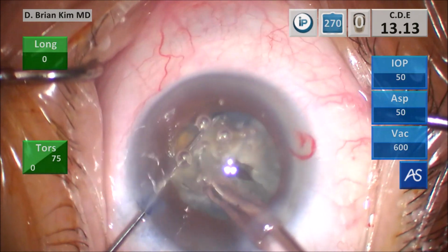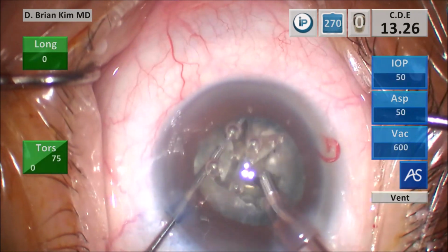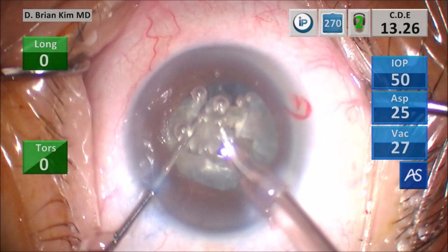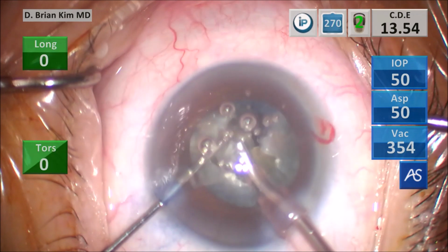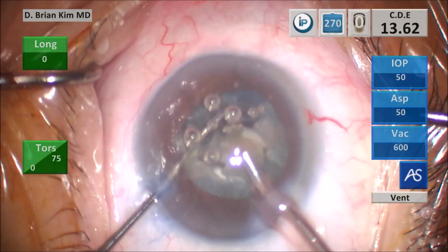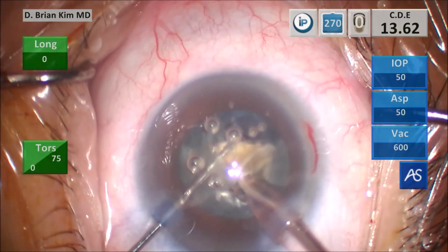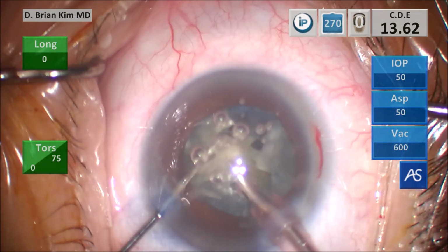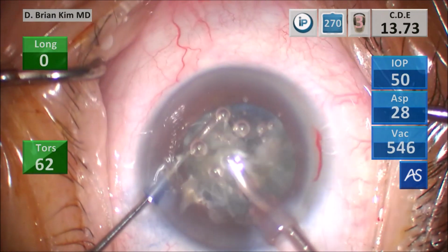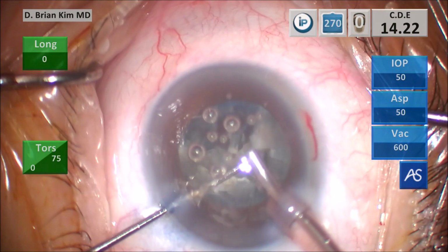Again, I'm doing this even though it's more difficult to see. Because I have confidence in my technique, I don't really care that I have bubbles in my view. I'm able to still execute the techniques, fracturing the lens into smaller and smaller pieces, performing double chop, cross chop, and then mechanical fracturing techniques. I'm able to remove those lens pieces, and you can see throughout this entire case, those bubbles have not moved. The bubbles are there from the very beginning.